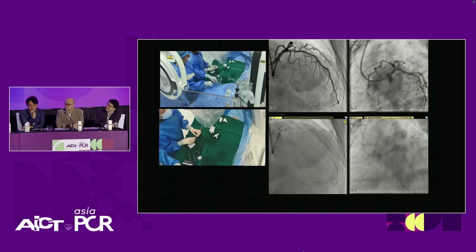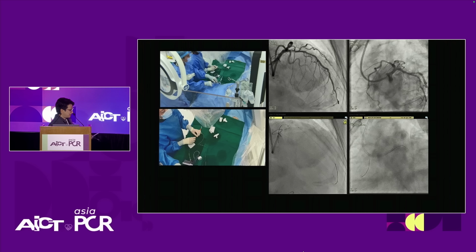All right, maybe we pause here. I think Chi-Teng, you wanted to ask what would be the next strategy, right? Whether we would upsize with a larger burr or use a cutting balloon or other strategy for lesion prep, following the description from Jason.